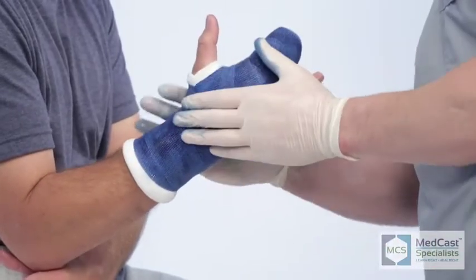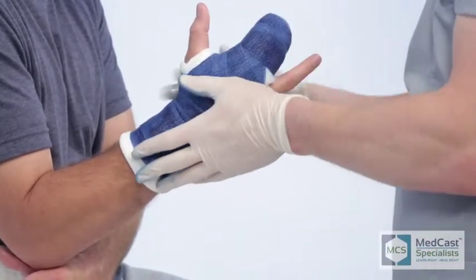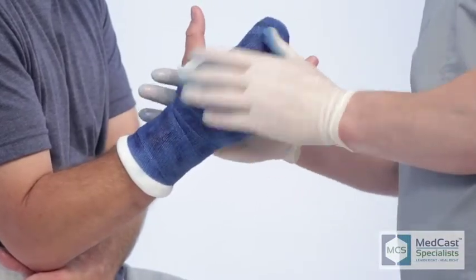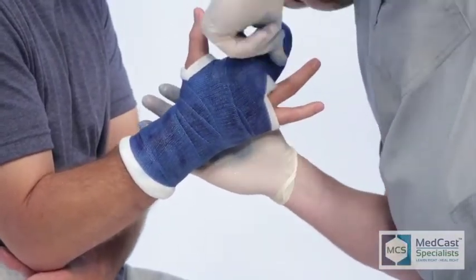So after you get your fiberglass on there, you want to keep in mind the positioning of the patient. You want the MCP joints as close to 90 degrees as you can. Wrist is in neutral or slight extension.